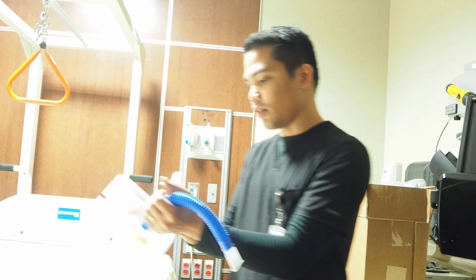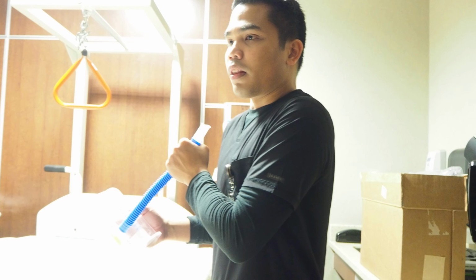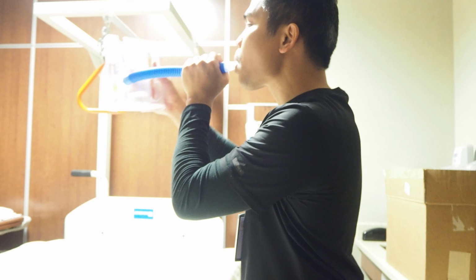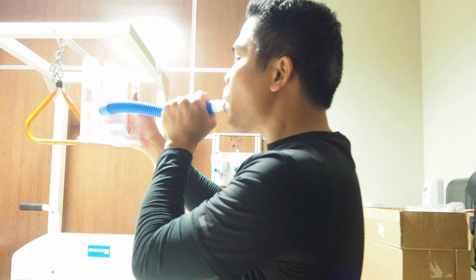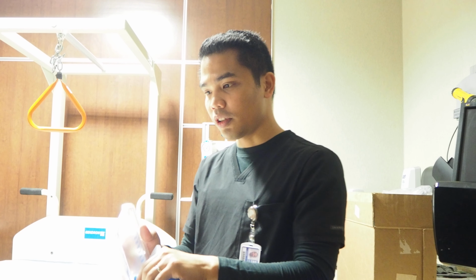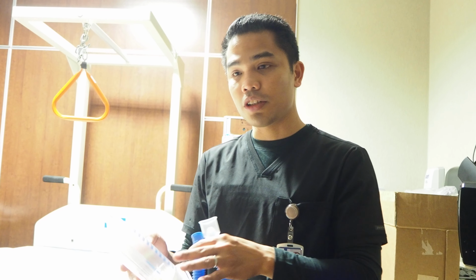So moving on, let's proceed while performing. So first I'm going to exhale all the air out. If you want to do this multiple times, the ideal is at least 10 times. But after every attempt, we let the patient rest for a few seconds.